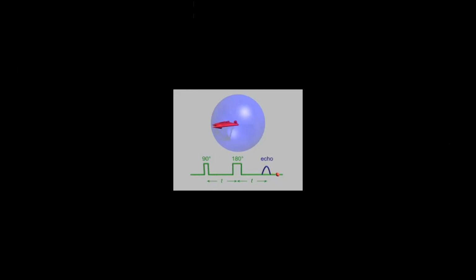So if we look at this diagram from Wikipedia, which we're all familiar with, first we have a 90-degree pulse, then our spins begin to dephase, then the 180-degree pulse actually flips everything around, and like I said, helps us out with rephasing because spins that were getting ahead in phase are now behind, and by precessing faster, they will catch up again. And spins that were precessing slower and falling behind, they're now ahead, and they'll lose that lead over time as the faster spins catch up. This isn't the only visualization I've got, but it's the most accurate to MRI.